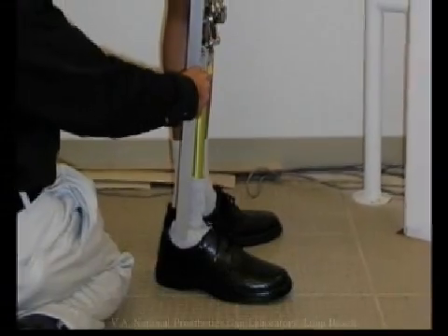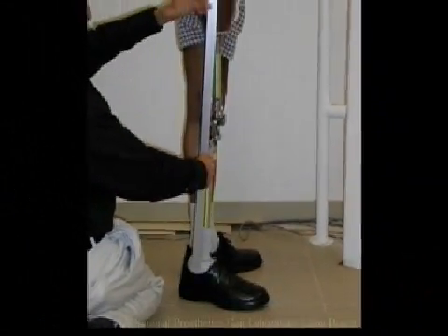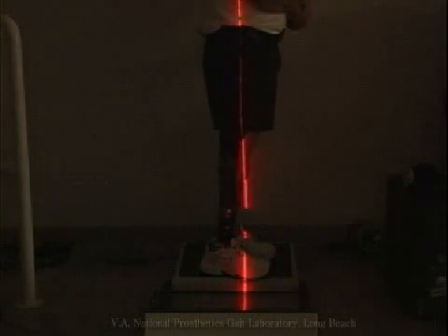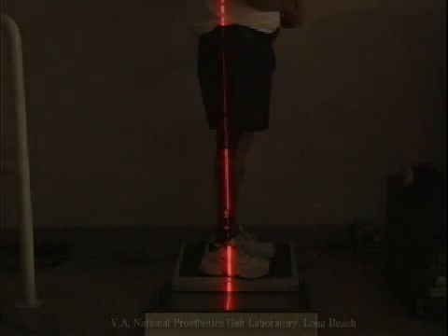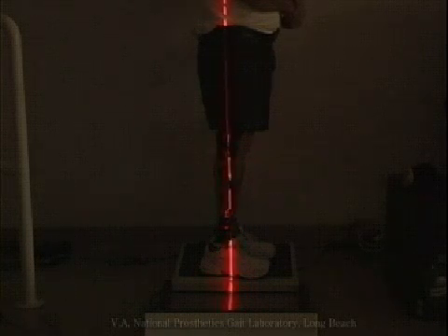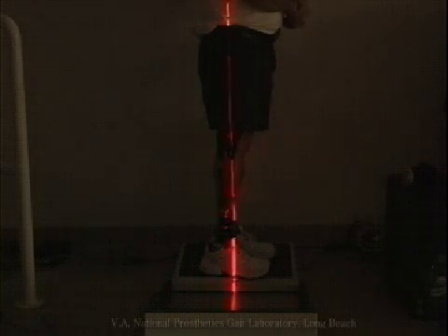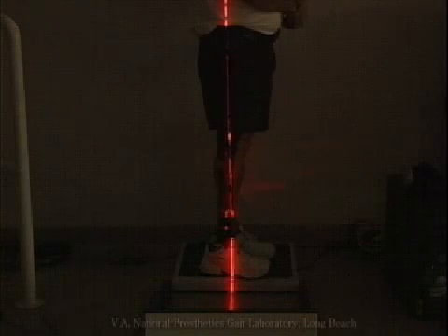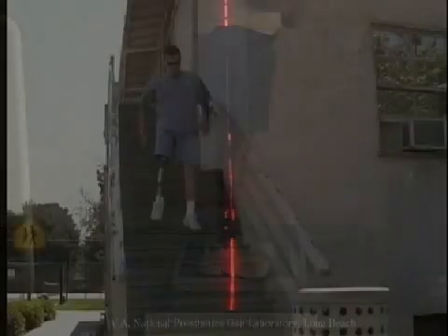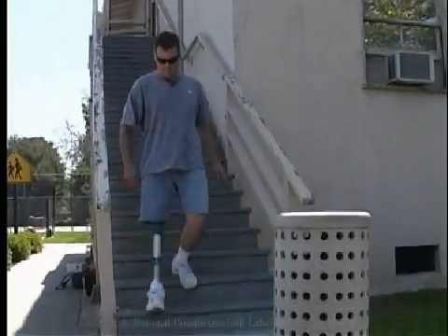This is referred to as the TKA, or trochanter knee-ankle line, and can be seen here projected upon the lateral surface of the limb. Knee instability can occur when the socket is too far posterior to this reference line. Due to the inherent mechanical stability provided in contemporary knee designs, historical concepts about the TKA line may not always apply.